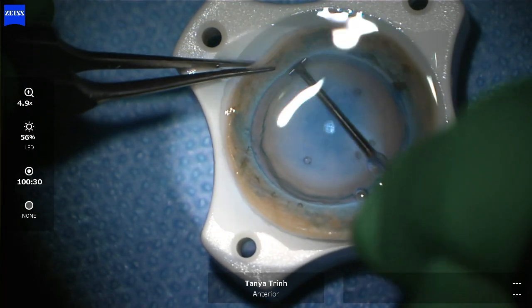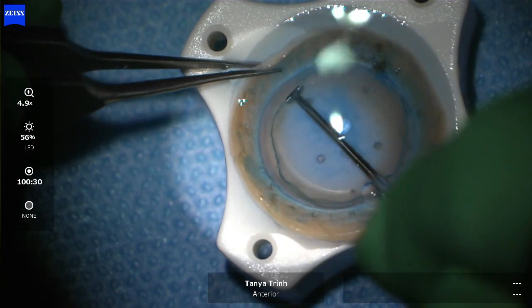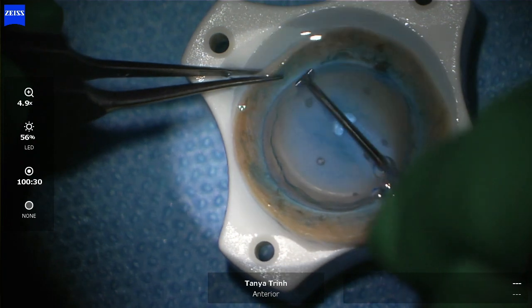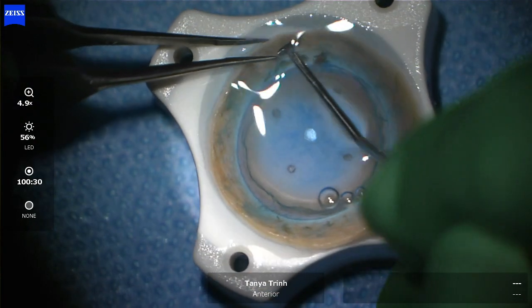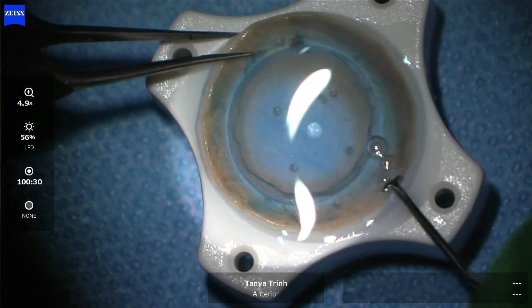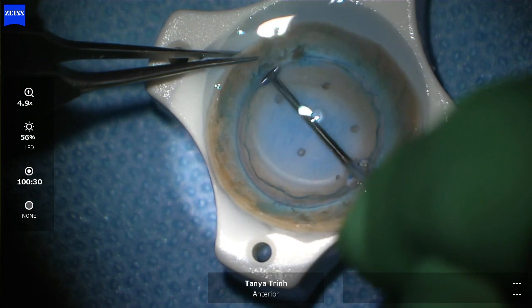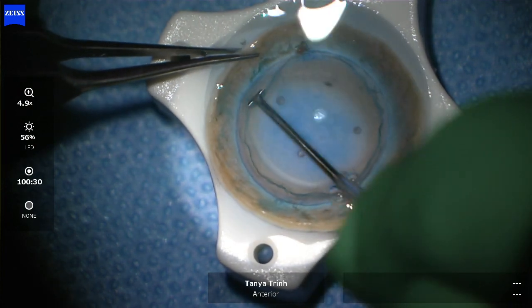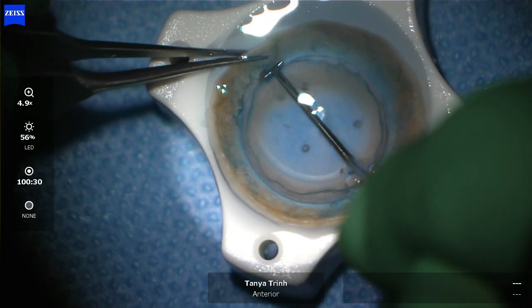If there are any stray tags which don't come away nicely, then I often find switching to having some Vannas scissors on board to trim the little adhesions can be quite helpful. This is really important because when you're trying to fold the tissue in half in the next step, those tractional bands can actually be the source of tears.